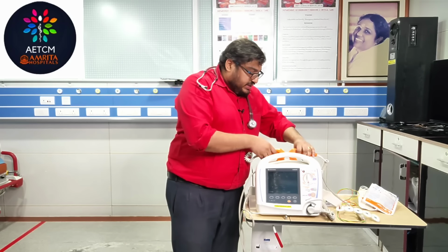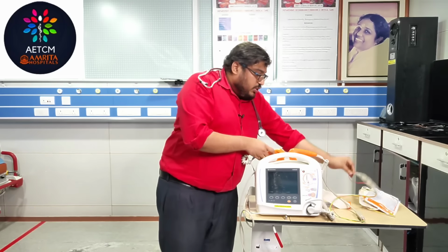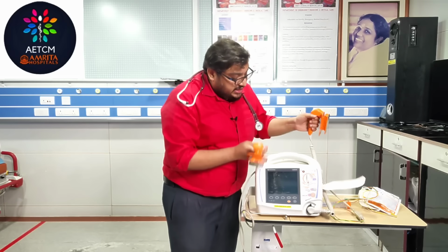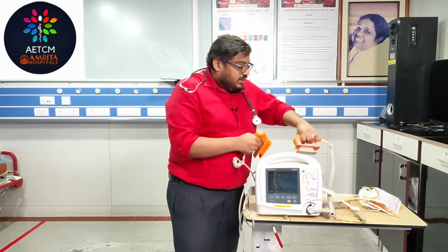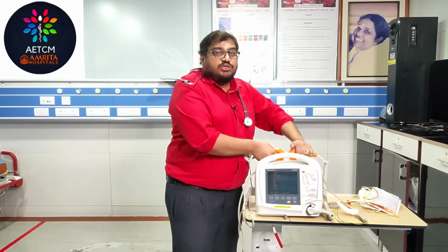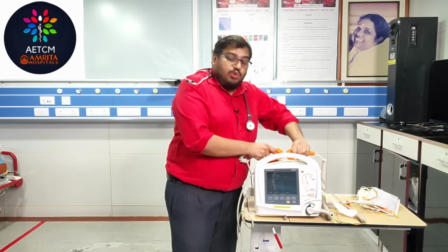And one more additional thing, sometimes you don't find these adhesive electrodes. You can keep the paddles with your gel on the chest wall. The machine will recognize the rhythm, and you can see the rhythm in the monitor, and you can see whether it's a shockable or a non-shockable rhythm. The scenario is that you don't have this electrode. Somebody has misplaced this cable. You only have this machine. Still you can keep this over the patient's chest, and you can see what the rhythm is.